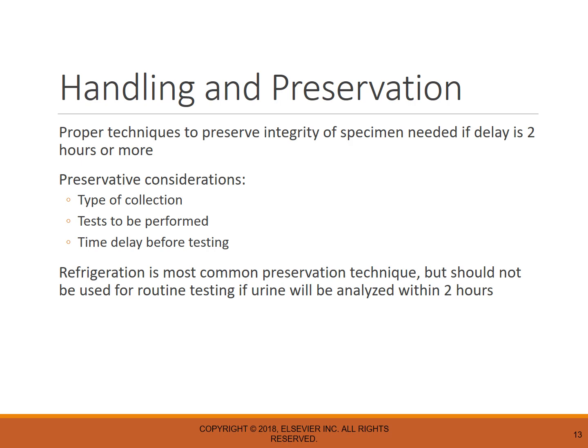But if we're considering a timed collection, particularly a 12 or 24-hour collection, it may require addition of a chemical preservative to maintain the integrity of the analyte of interest. Regardless of the preservative necessary, urine collections should be kept on ice or refrigerated throughout the duration of the process. The collection preservative varies depending on specific things such as the test method, how often the test is performed, and the time delay in transport conditions.